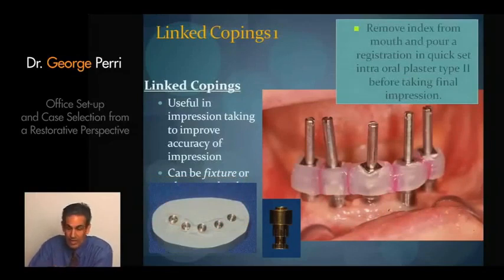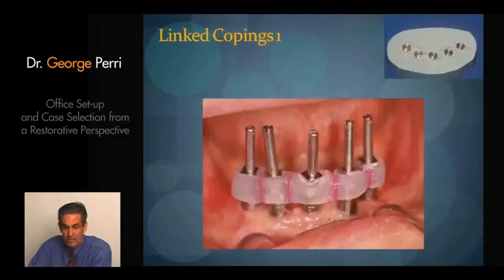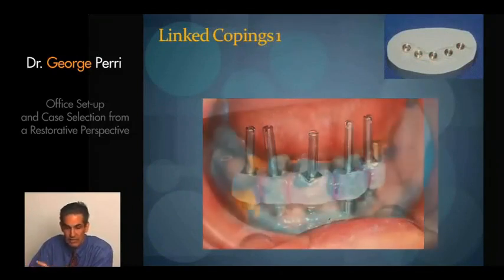I'll tell you honestly that I don't do this component anymore because I have such confidence in my laboratory, but it's up to you to evaluate that. We then place this linked coping back in the mouth. While the registration is setting, I'm quite honestly border molding my tray. I'm ready to take the impression.